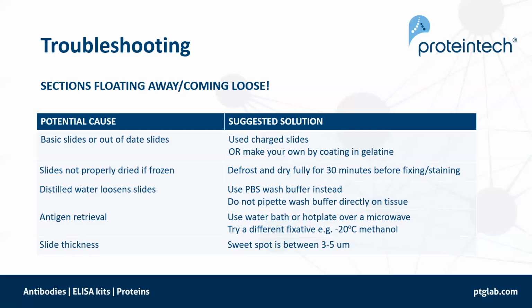And slide thickness as well. At Proteintech, we consider the sweet spot for sections to stick to the slide is between 3 and 5 microns.